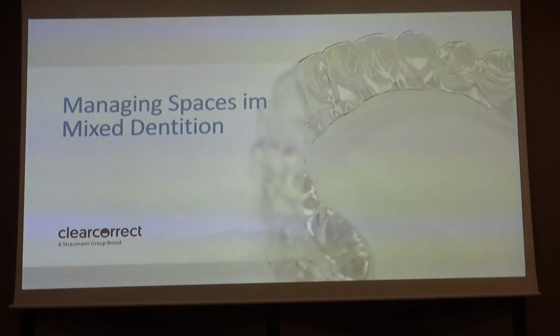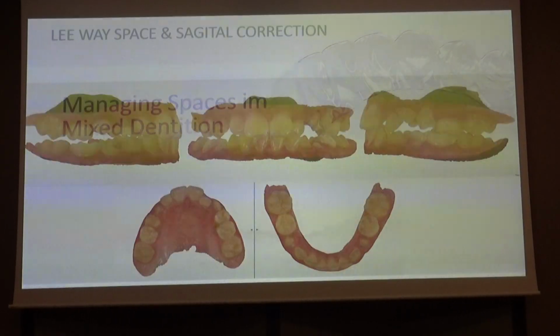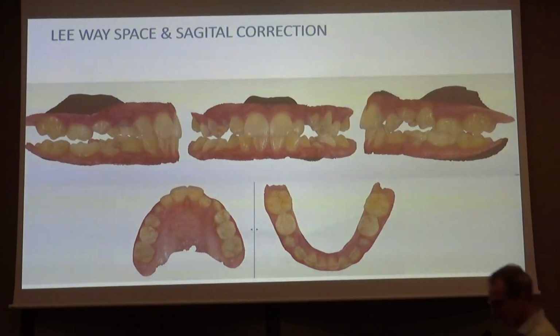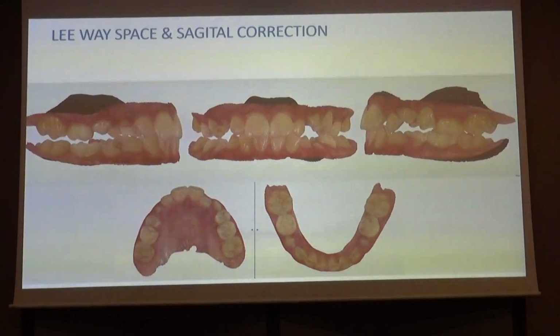Let's talk about mixed dentition, some cases in mixed dentition. For me, it's a great advantage, the aligner therapy in mixed dentition. Why? Because for years and years, orthodontics used to apply the 2x4 mechanics in mixed dentition.